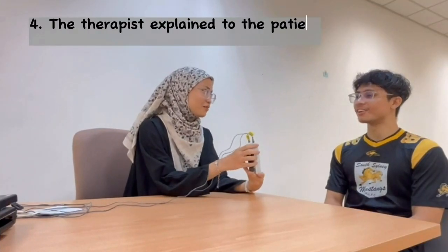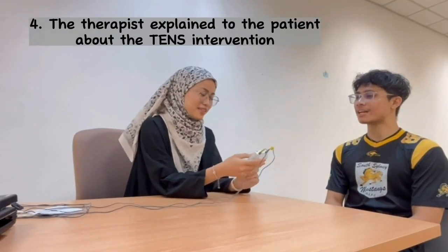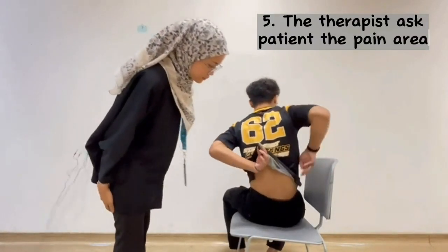Next, the therapist explains to the patient about the TENS intervention. After that, the therapist asks the patient where the pain area is.